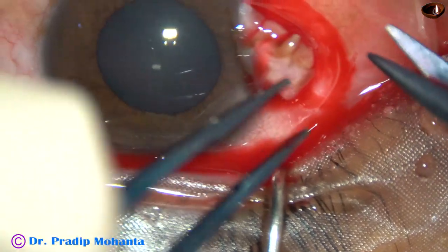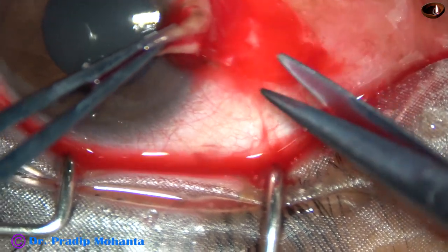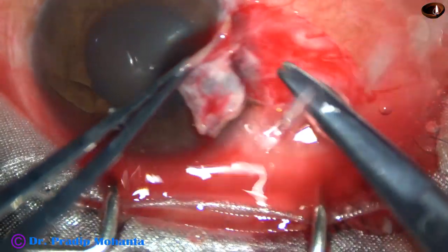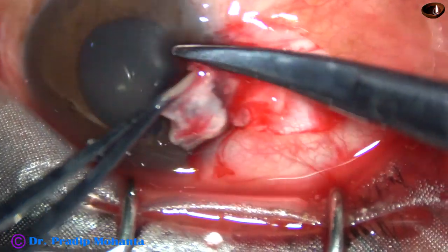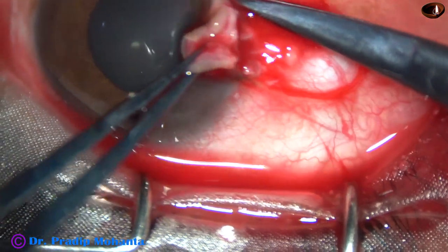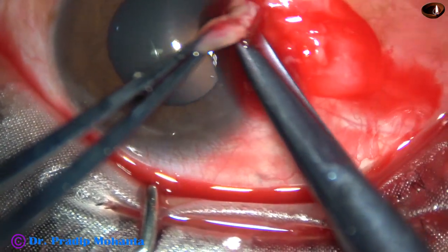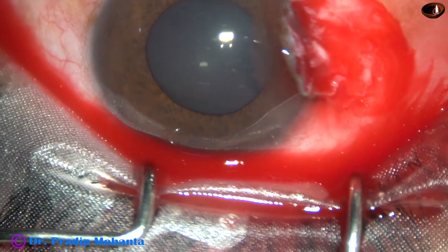Excision of the pterygium is ongoing. I am just removing the thick conjunctiva and subconjunctival tissue. I am going to remove this. I will use the crescent blade a little later to remove this tissue.